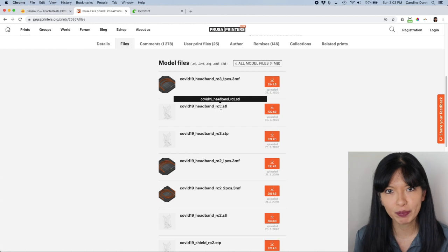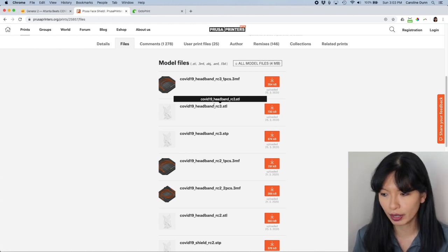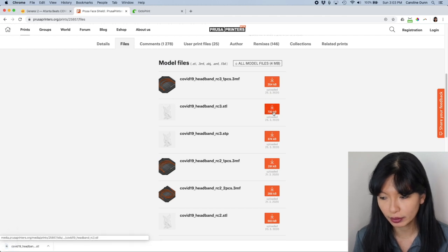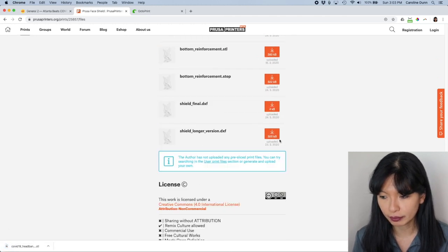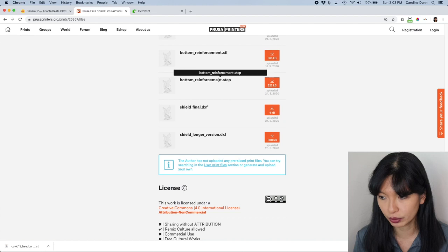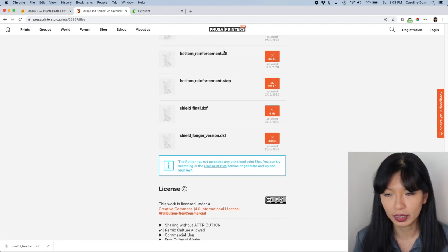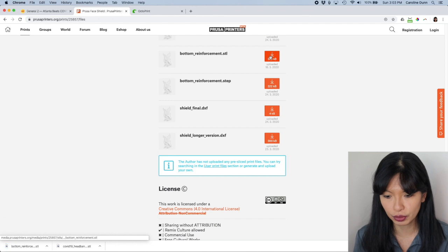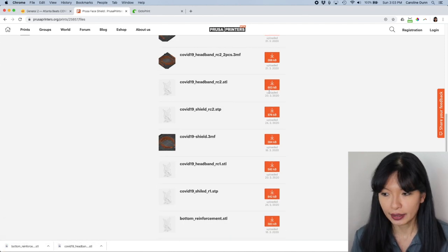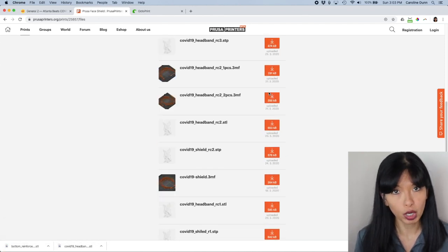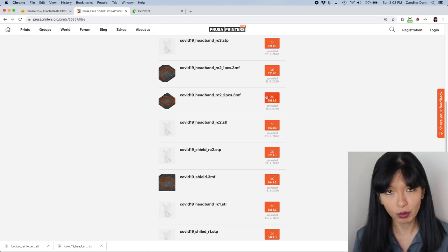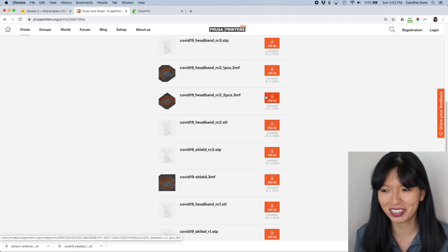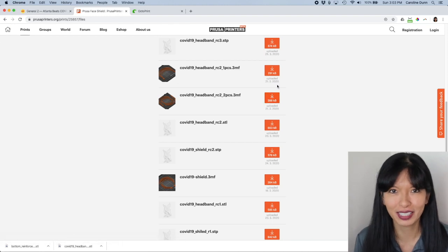For the purposes of this video, the latest design is RC3. I'm going to download that one. And then I'm also going to scroll down and I am going to download bottom underscore reinforcement dot STL. Those are the two main files that I need. And this is what I would recommend that you start with if you're going to do this at your home. And I hope that you will be firing up your 3D printer to help your community in the fight against COVID-19.